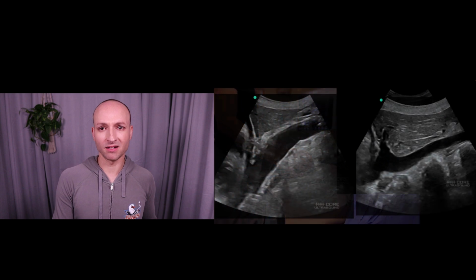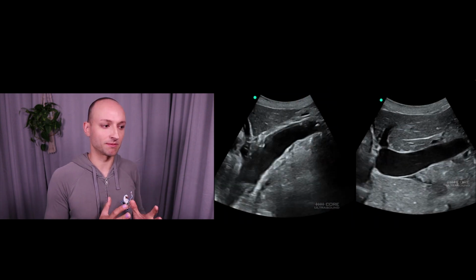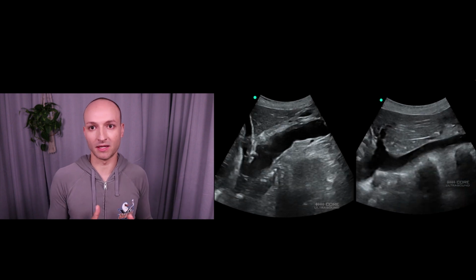Now, a couple of things on how to identify the IVC, because it actually happens. The IVC and the aorta, sometimes you can get kind of confused about what they are.